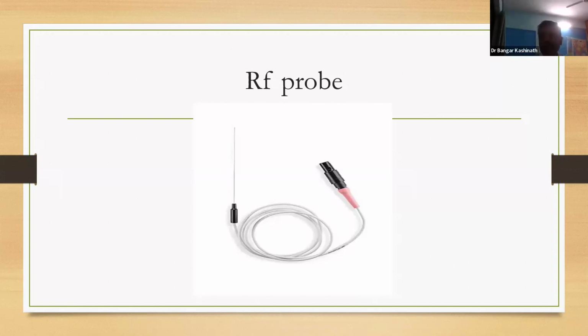By the way, those are not absolutely correct answers. It actually senses the heat generated at the tip, records the heat and transmits it back. Correct.